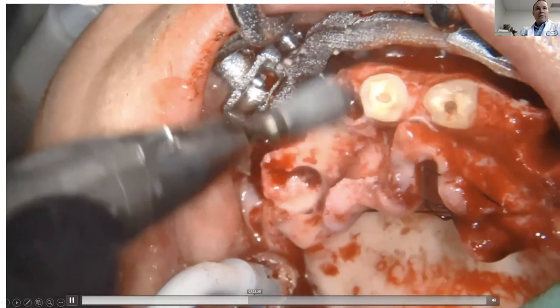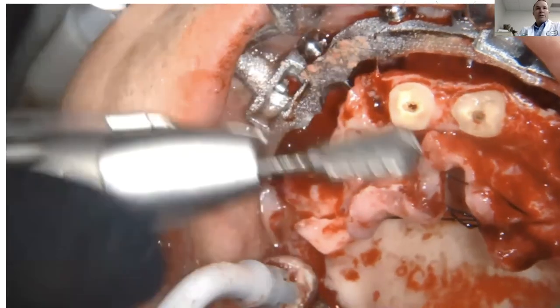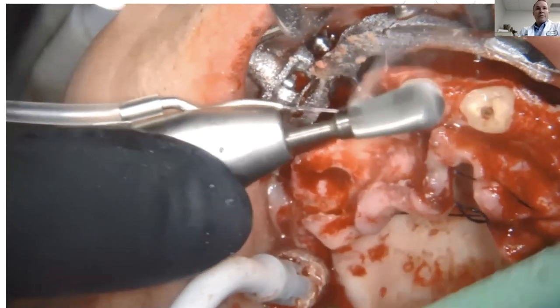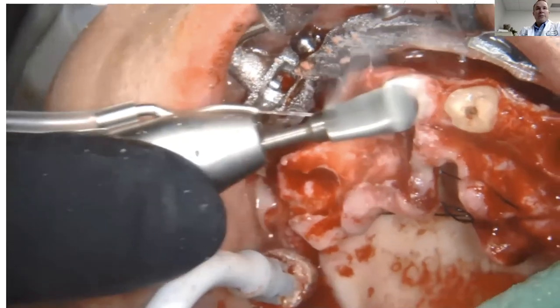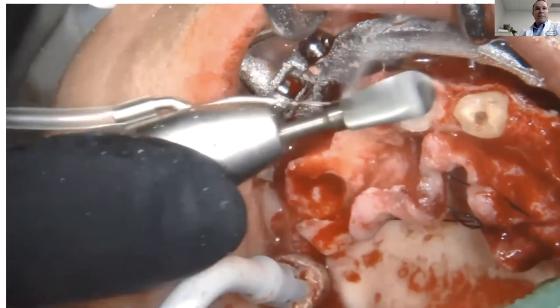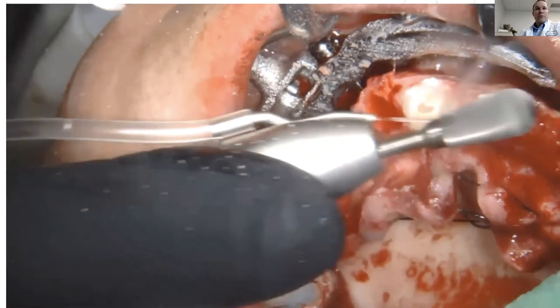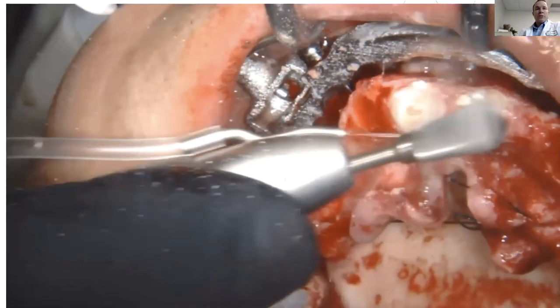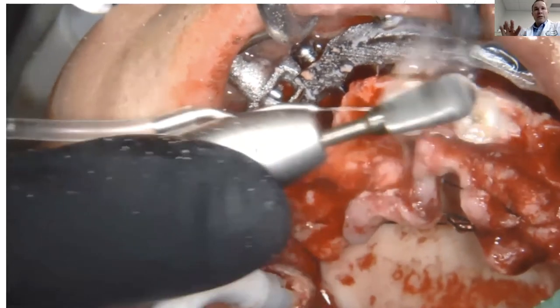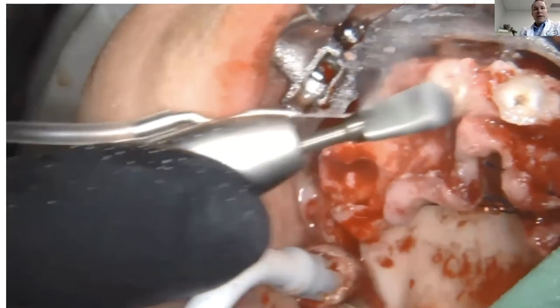Once all pins are in, undo the Chrome locks, remove the pin guide, and proceed with tooth adjustment and extraction. In this case the patient had large metal PFM bridgework — that was removed. The plan was partial extraction therapy: leaving most roots at the gum line rather than full extractions, cutting the teeth down to the ridge and performing PET. The doctor chose which teeth to perform partial extraction therapy on — often just the centrals or the front six teeth.